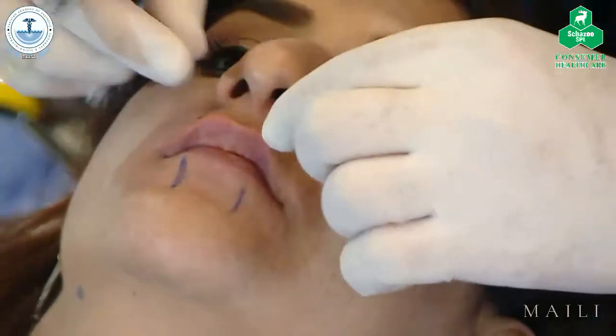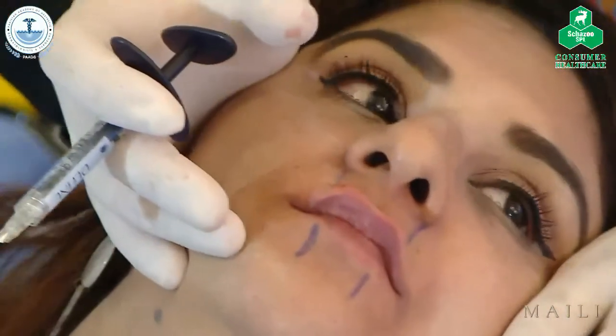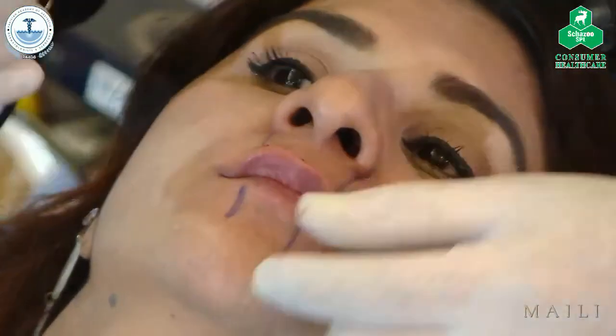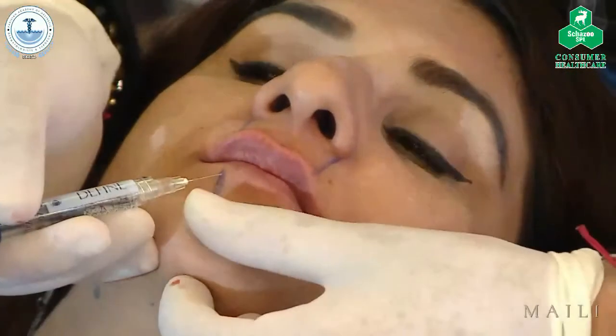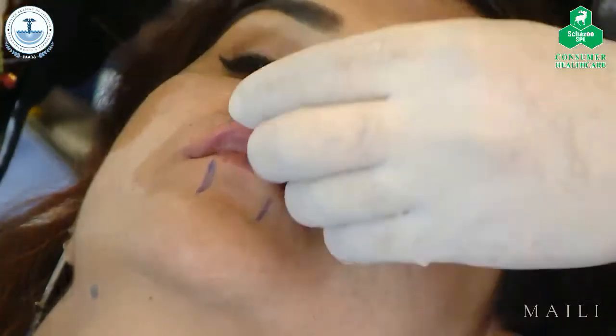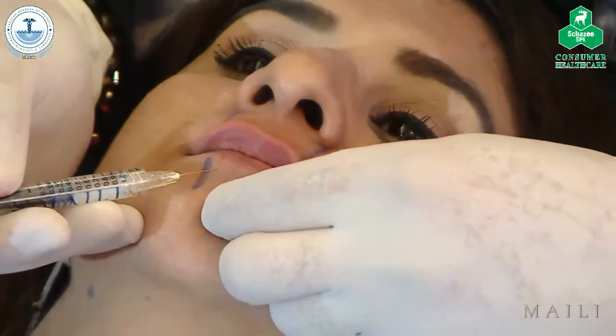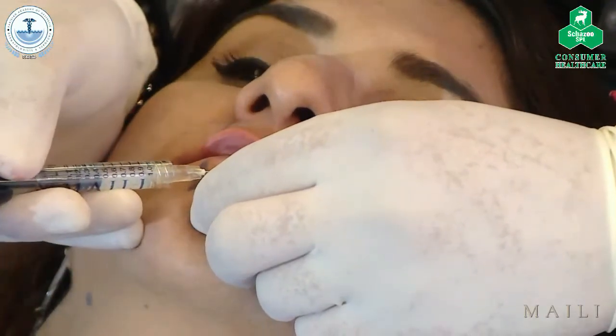So as far as augmentation, I'm happy with the augmentation I have so far. Now I'm going to do the exact same thing with the lower. How much have you injected up till now? 0.3. 0.3? Yeah. Good job. What a nice change with 0.3.